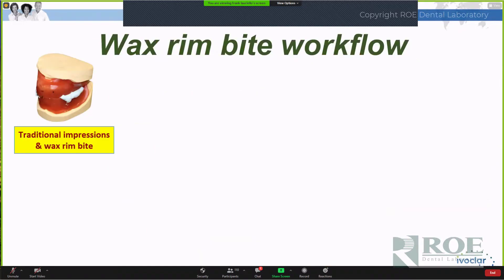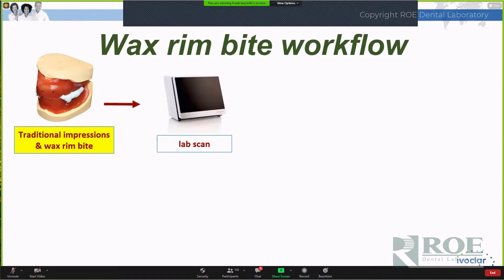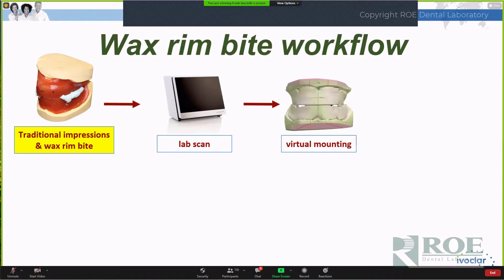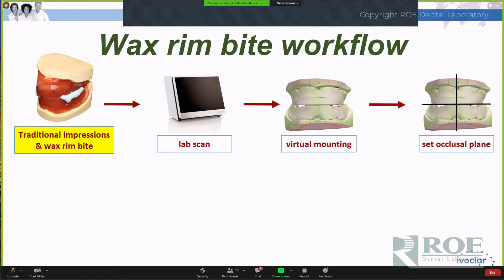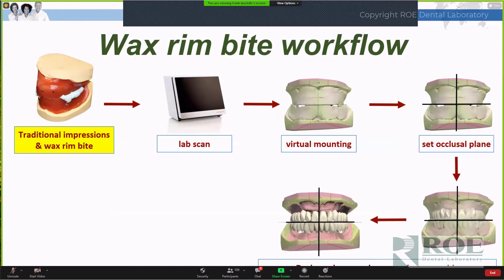We start with traditional impressions and wax rim bite and scan that. Once scanned, we have virtual models mounted according to the wax rim bite registration. We then utilize the wax rim as a guide — in this case, starting with setting the occlusal plane. This crosshair translates the information into midline, inclination, occlusal plane, interpupillary line, and incisal length of the maxillary teeth.